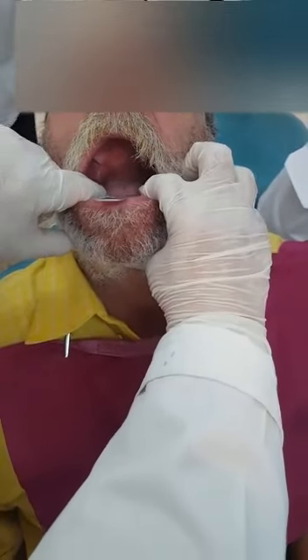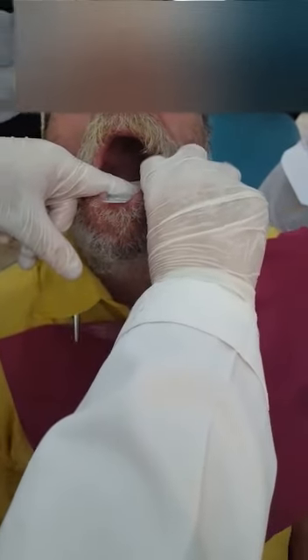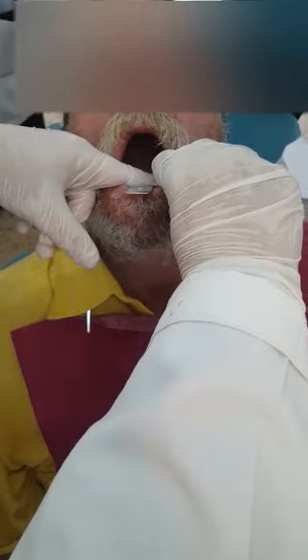I begin loading vertically. The metal has reached the sulcus. If it's hurting while I'm pressing, that means the metal is pressing inside the sulcus — maybe I'm squeezing too much. Once I'm inside, I begin border molding.